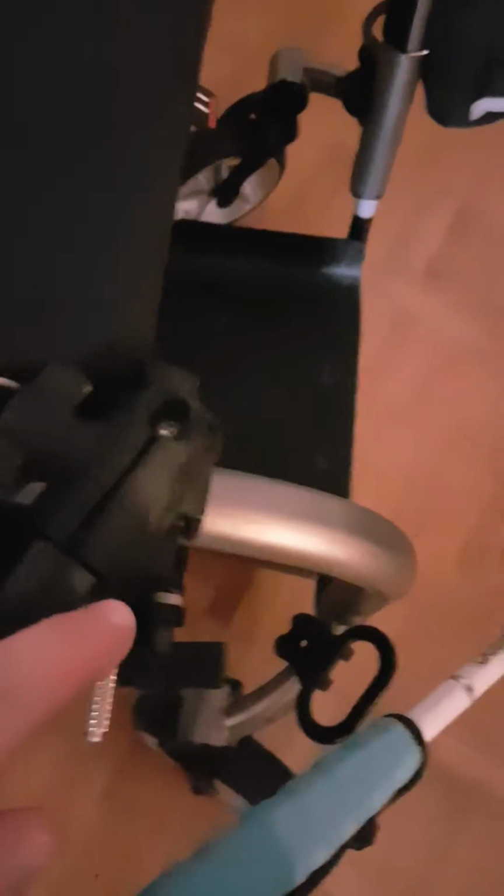And believe me, you want everything tight. The clamps and the sockets on the swivel arm, you want them all very tight. Even if it feels like you're over-tightening, go as tight as you possibly can, because otherwise they loosen up with vibration and movement, so you want them tight. Once they start to loosen up, then your positioning gets all messed up. So that's the first arm.